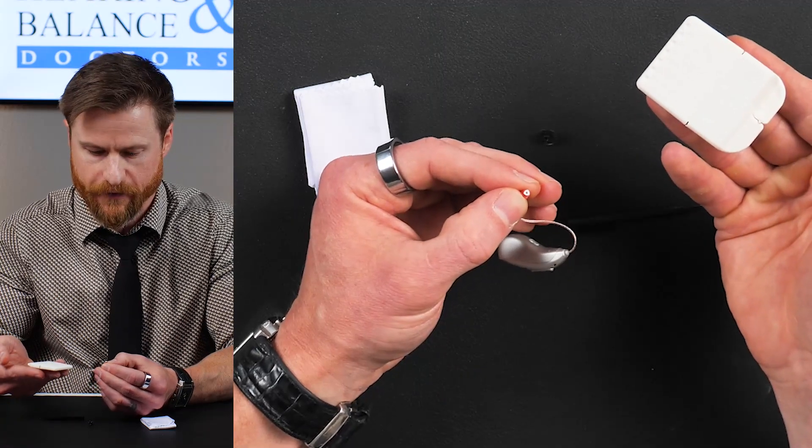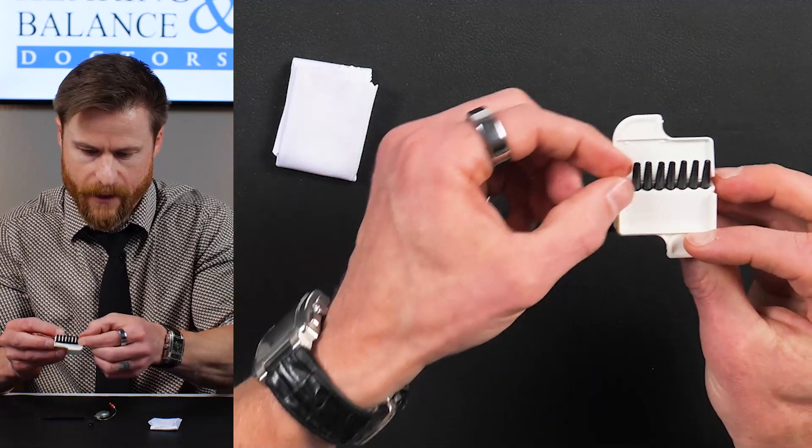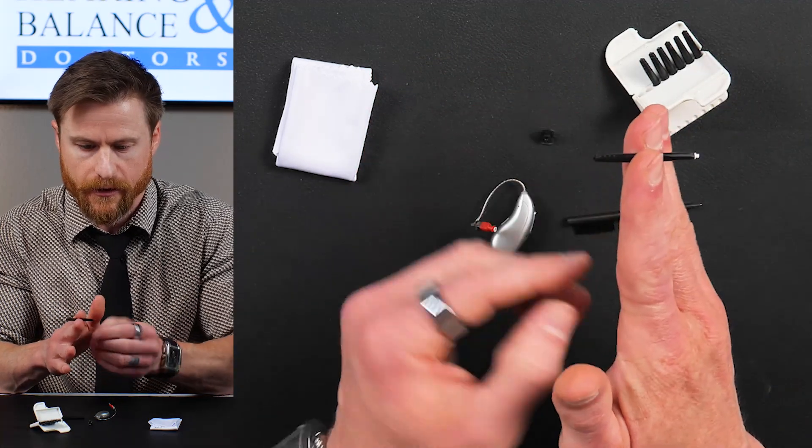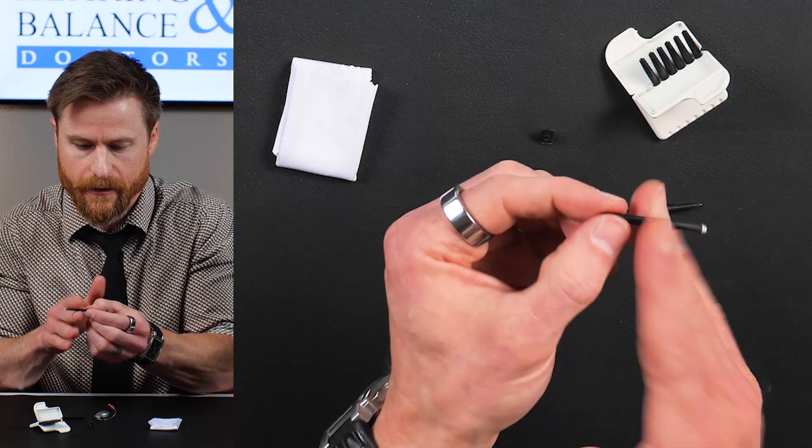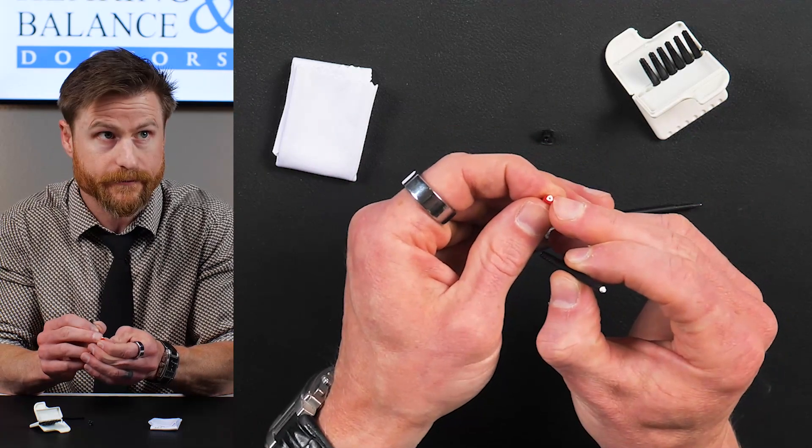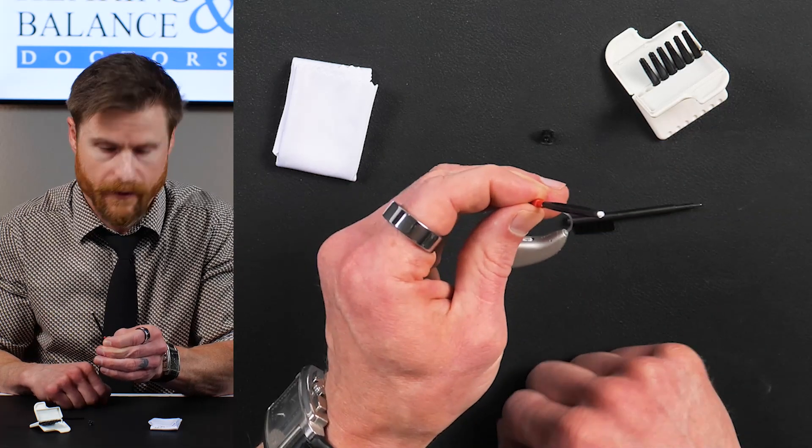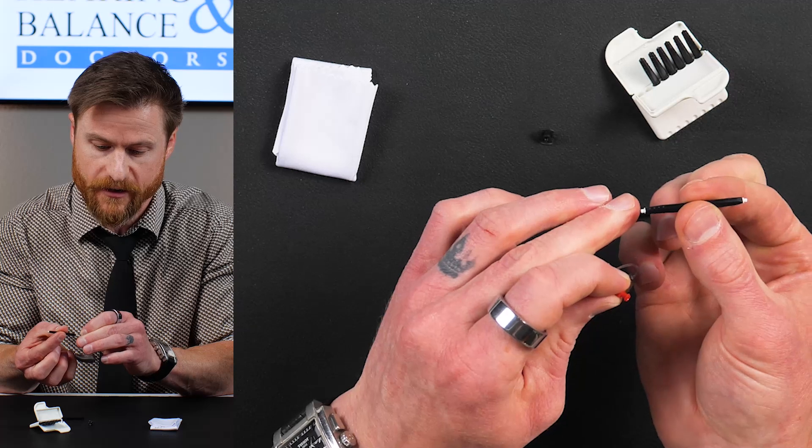So you have these extra filters here. Look, there's a bunch of them. We're going to take one out. Little matchstick. Look, there's a black side and a white side. Let's use the black side to take out the dirty filter. So you've got to push it right in. And then you just pull it out. Dirty filter came right out.